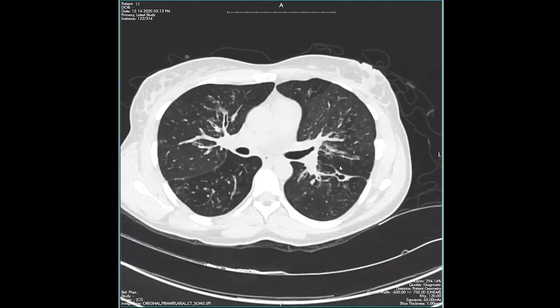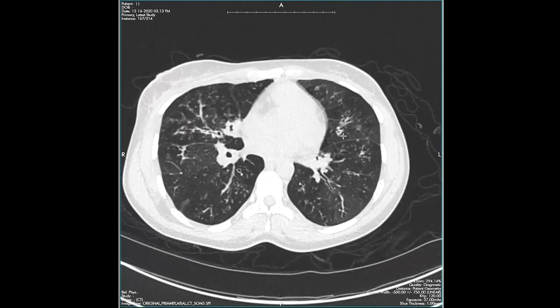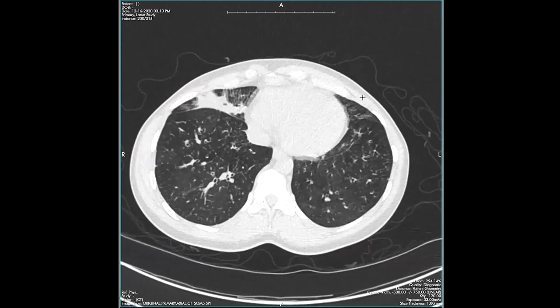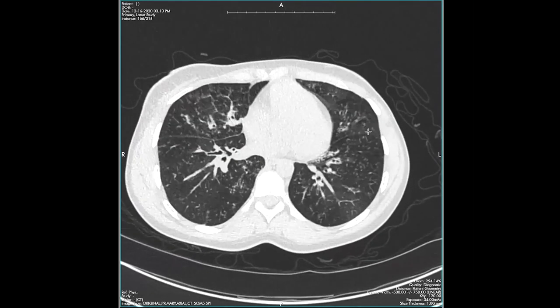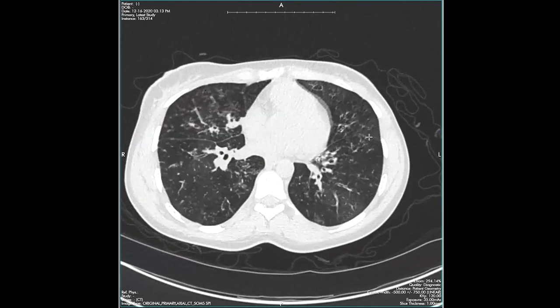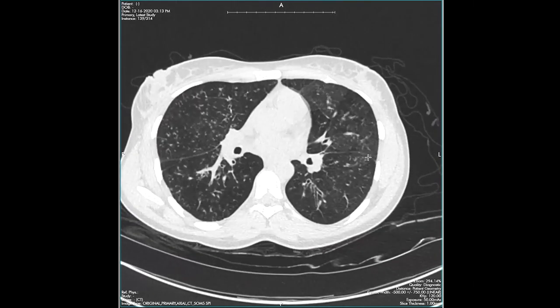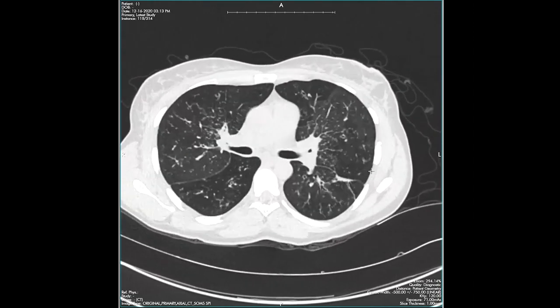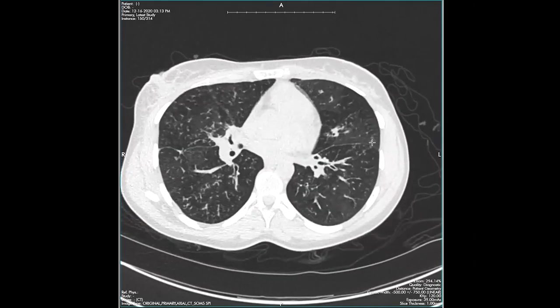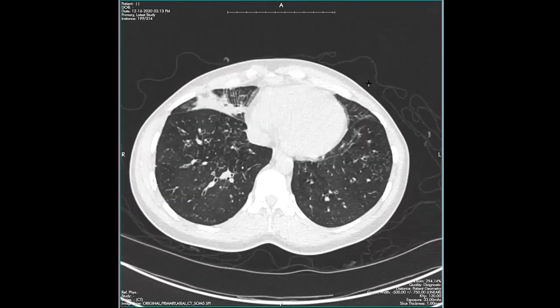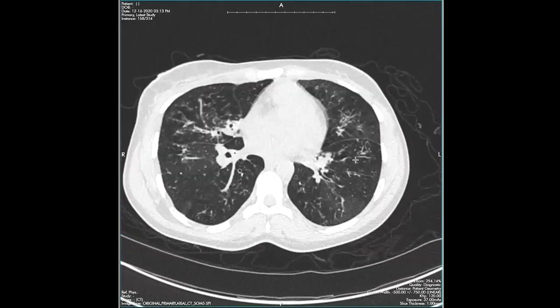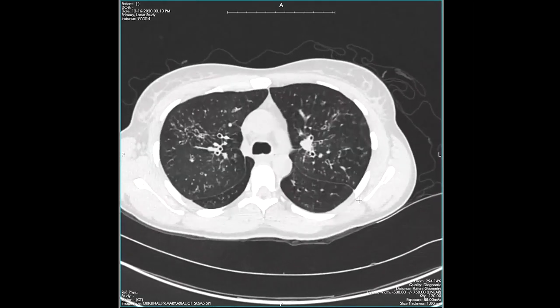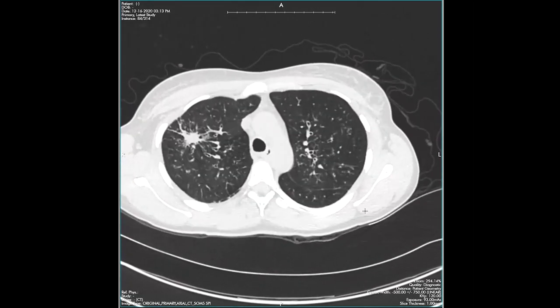When we see that, our top two differential diagnoses should be sarcoidosis or perilymphatic disease related to lymphangitic carcinomatosis. We don't see a lot of smooth septal thickening though. The absence of smooth septal thickening should lead us away from lymphangitic tumor and more towards sarcoid.